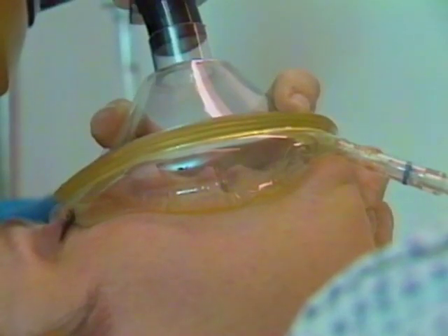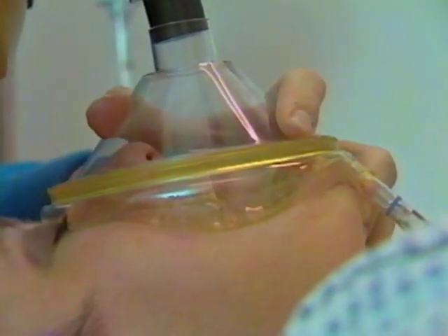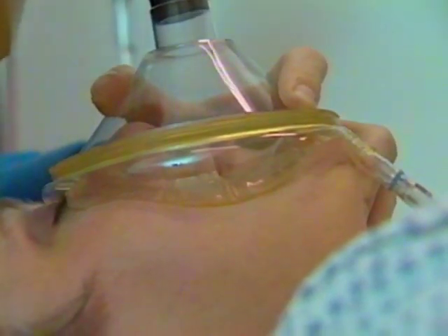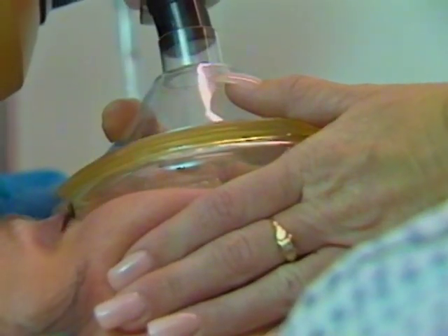To make it better, rotate the ventilation bag attachment to change the point of maximum pressure. Reposition your hands if necessary. If you have an assistant, ask him or her to push the cheek up against the outside of the mask at the leak sites.